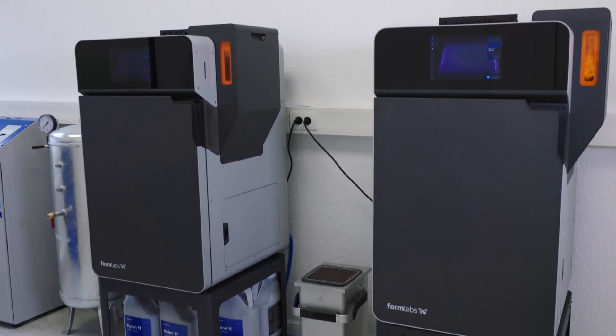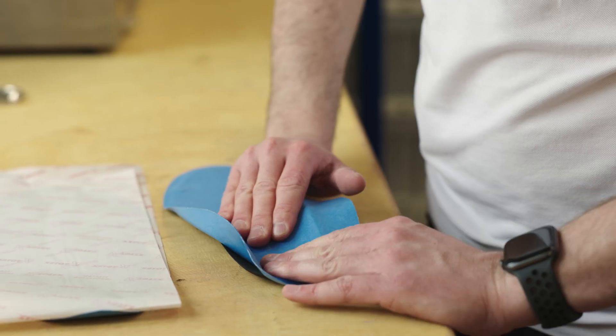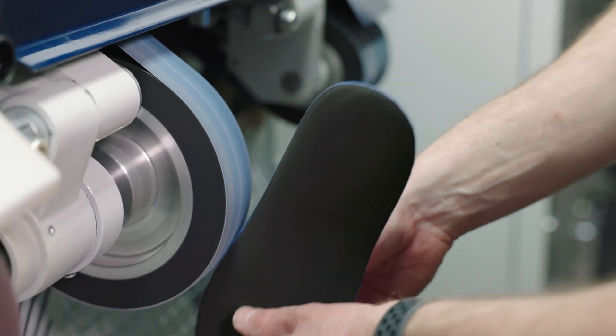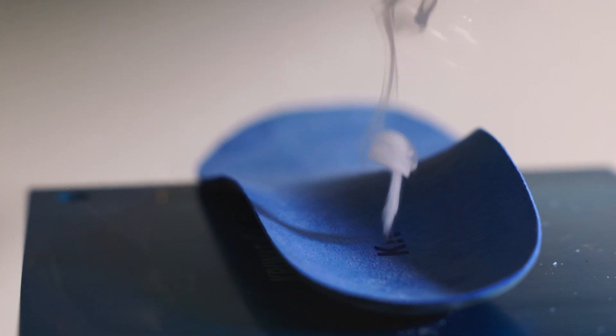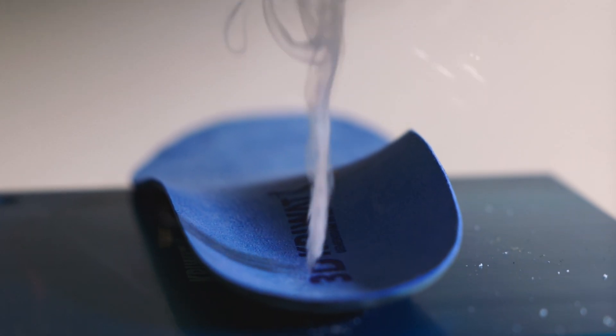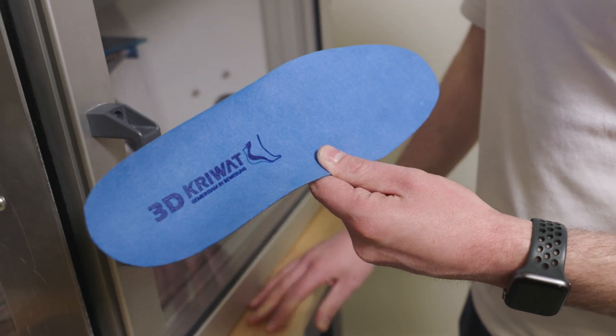In the next full year, our aim is to print around 10,000 insole shells and full insoles. We have two Fuse 1 printers, and with these printers, we plan to print that many insoles in the next years. But it is still possible to scale even more, which gives us a lot of possibilities for the future. The first step was to digitize traditional craftsmanship. The next step will be to create entirely new products which are based completely on 3D technology. I'm really looking forward to bringing new innovations to market that perhaps wouldn't have been feasible 15 years ago, but now they're possible thanks to 3D technologies.